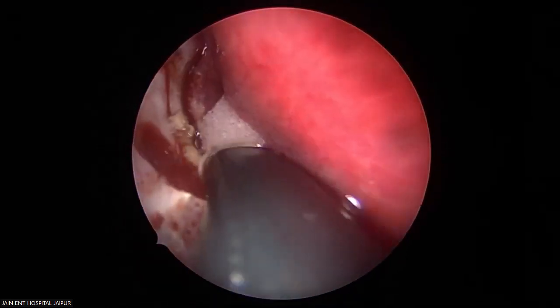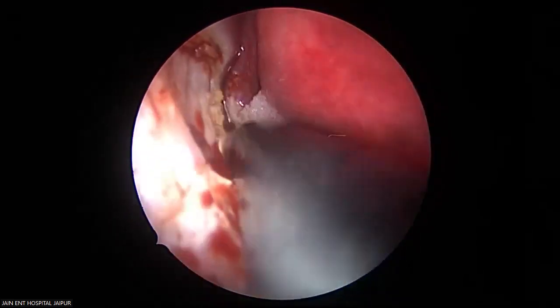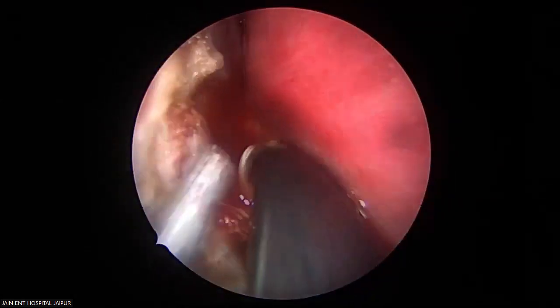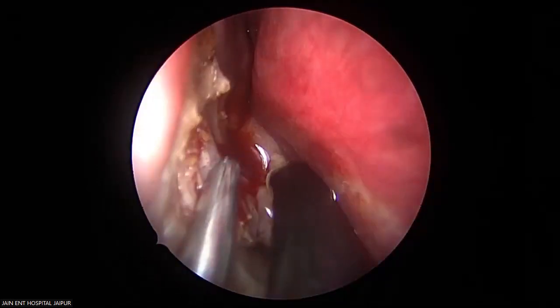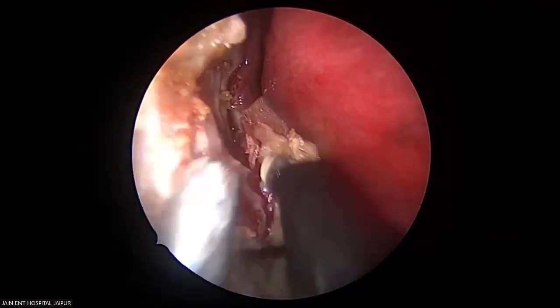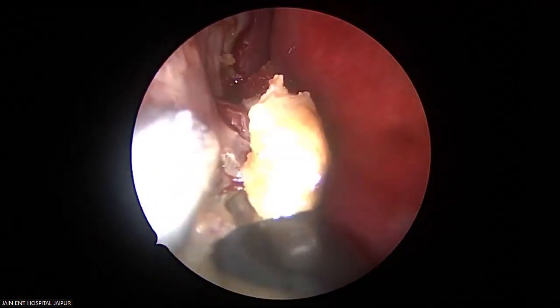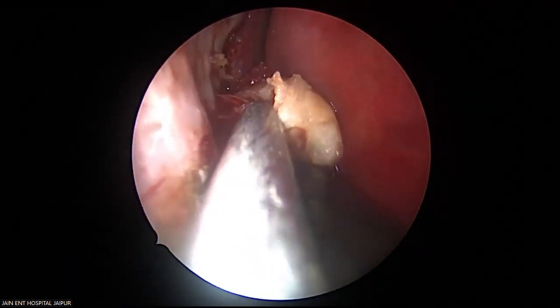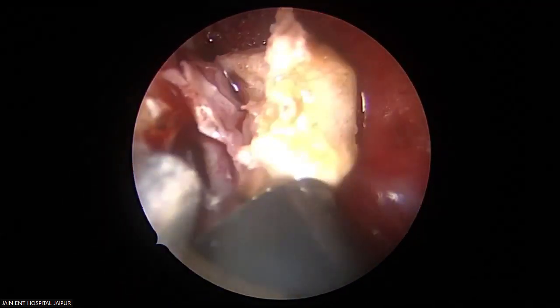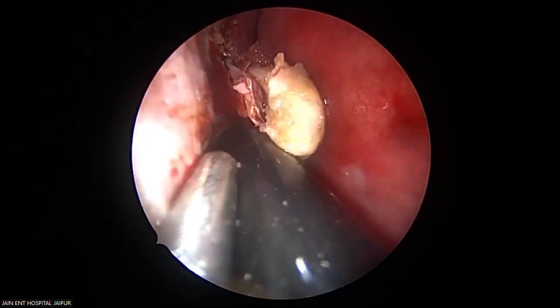If the bleeding comes from the bone, see this? Never try to use the coblator. This is the inferior turbinate, which is a separate bone which I am taking off. This is the bone of the inferior turbinate. And this is where the inferior meatus is. See this inferior meatus? Very clearly. So now I can take all this inferior meatus mucoperiosteum as well.